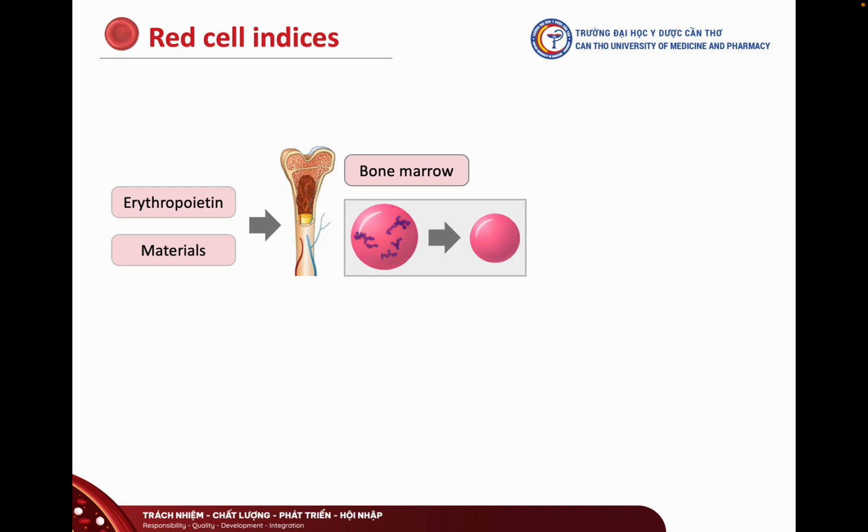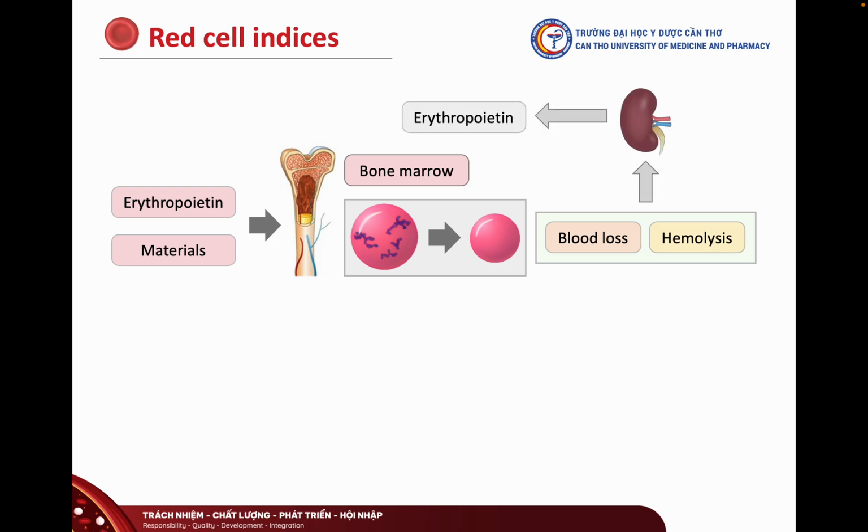And here is the important clinical insight. Reticulocytes are quite a bit bigger than normal red cells. So when you have a lot of them, like in hemolysis or after bleeding, they push our MCV upward. That is why one possible cause of macrocytosis is reticulocytosis, even though the red cells themselves are normal in size once they mature.